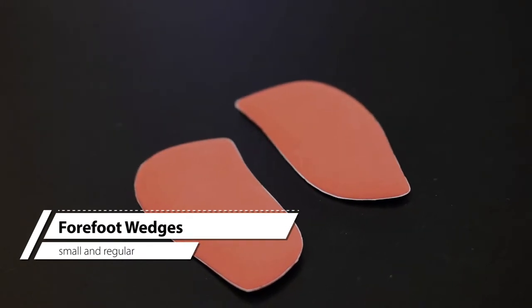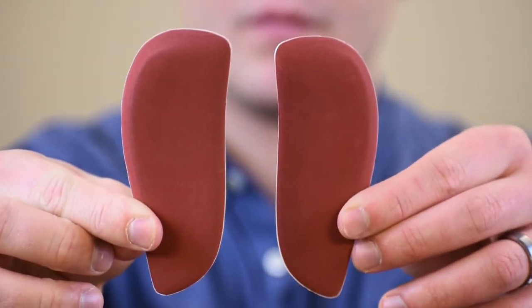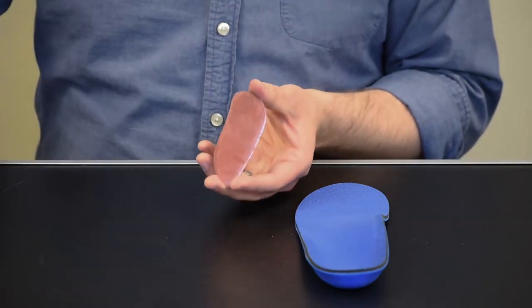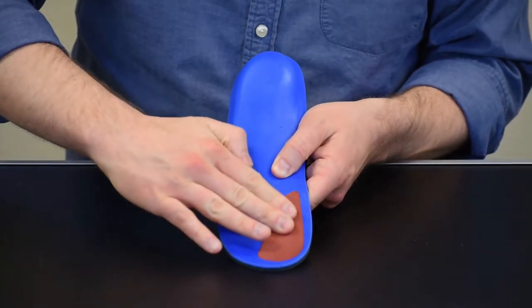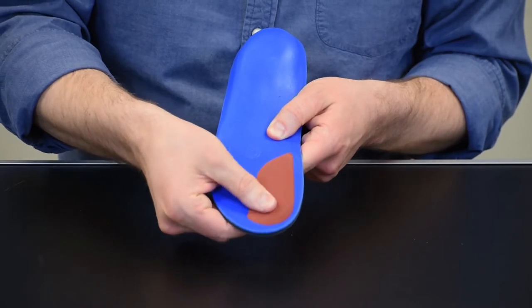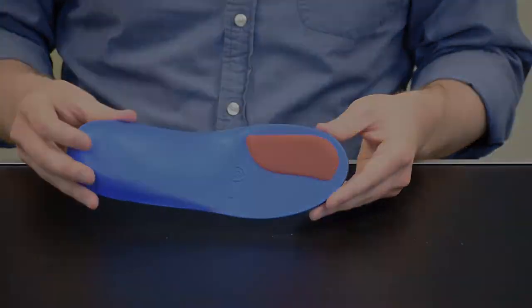Forefoot wedges are designed to account for forefoot varus or supinatus. These come in small and regular sizes and are left-right specific. To apply, select the correct size and side, remove the adhesive backing, and attach on the bottom of the orthotic directly under the big toe. The thicker part should be on the medial side of the orthotic to provide medial support. The wedge should follow the edge of the orthotic but with a one-quarter inch gap in between. Adjust the position as necessary for comfort.